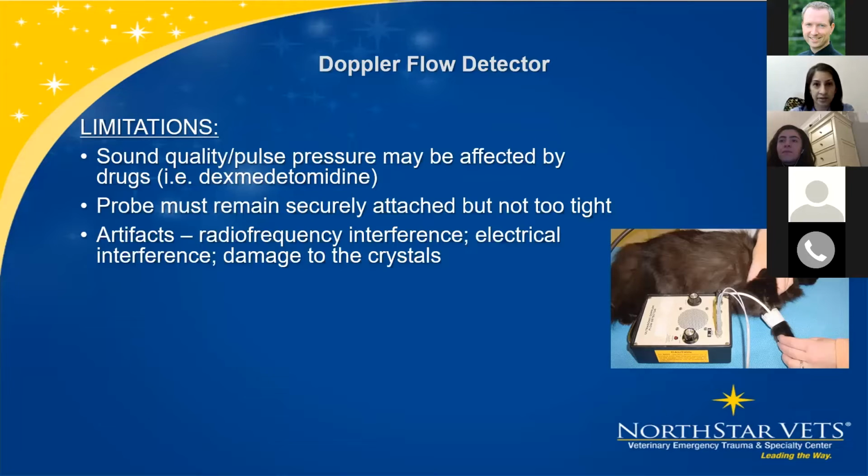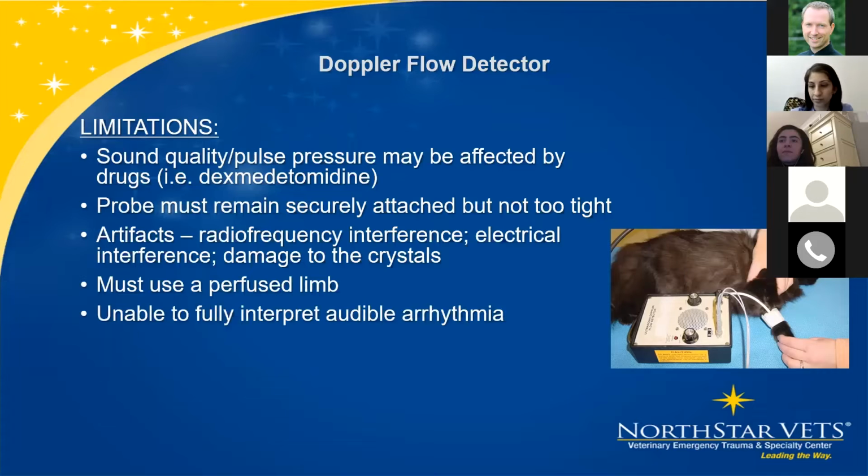Another problem is that the box may actually pick up some radio frequency interference, and that can distort the sound, cause background static. Any damage to the crystals will also affect the sound quality of the Doppler. Needless to mention, you do have to use a limb which is perfused in order for it to work.